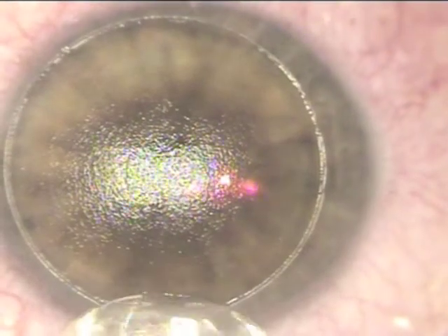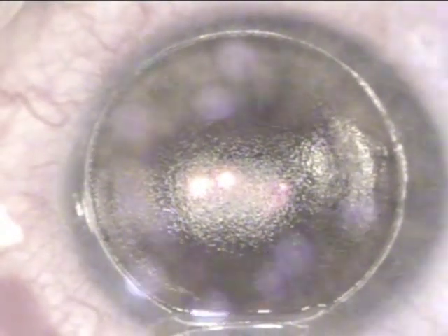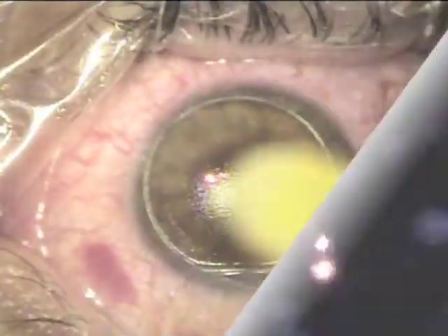Carefully reflect the flap onto itself, and here you can see the hyperopic ablation, and again how it fits perfectly in this 9 mm femtoflap.